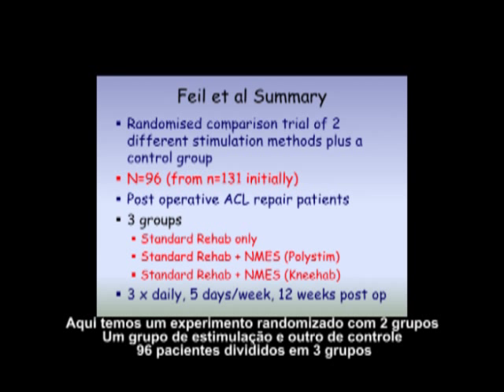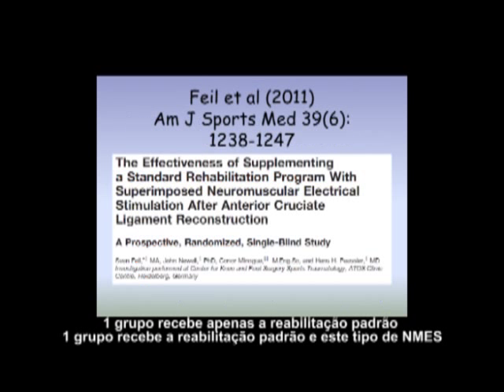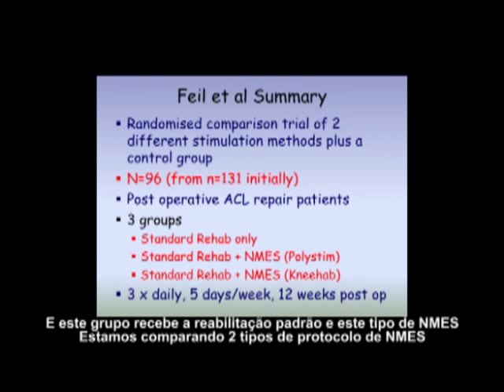Okay, so it's a randomized trial. You've got 2 groups of stimulation and a control group. So your patients, and there's 96 of them, are divided into 3 groups. 1 group gets standard rehab only. 1 group gets standard rehab and this type of NMES, and this group gets standard rehab and this type of NMES.